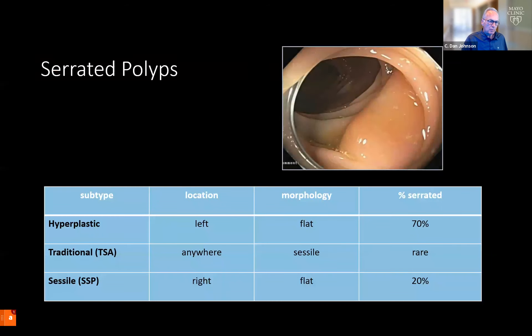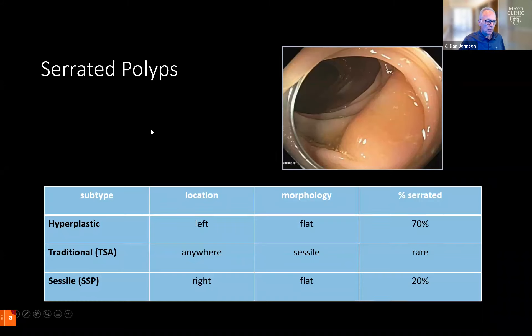Serrated polyps are relatively new pathological diagnoses. They're usually flat lesions as seen here, flesh colored with a mucin cap on their surface. In the past, these were all referred to as hyperplastic polyps, which are still described today — usually in the rectosigmoid, small, and benign. Traditional serrated adenomas can be anywhere; they have usual morphology and are more easily detected, but account for less than 10% of all these lesions.